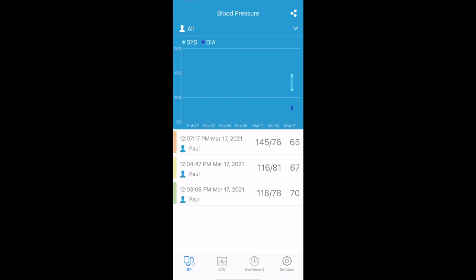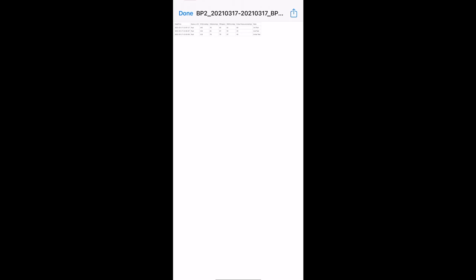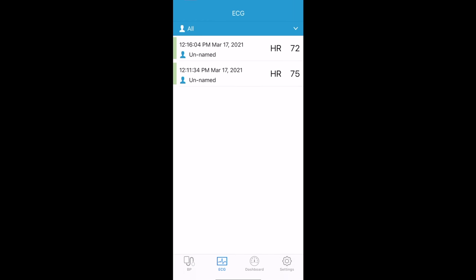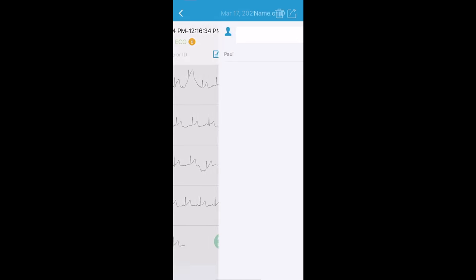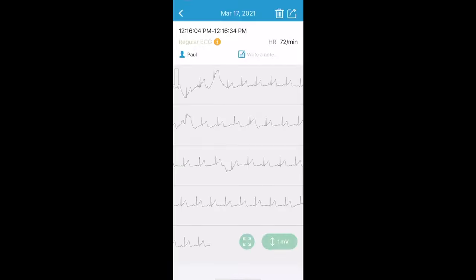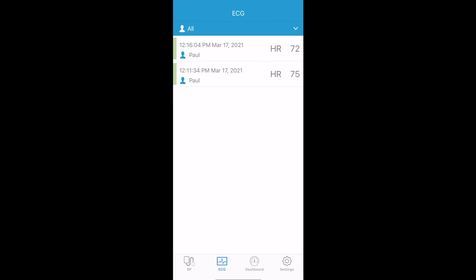You can share blood pressure records as a PDF — by the month, every day, or any range — and it'll give you a graph that you can share wherever you want: files, folders, or any drive. You can do the exact same thing with ECG data. The ECG graph shows all the readings, and you can view it in landscape as well. I love how you can see all this information right out of the app from this little monitor. You can analyze it however you like, and also change the name on each ECG test.